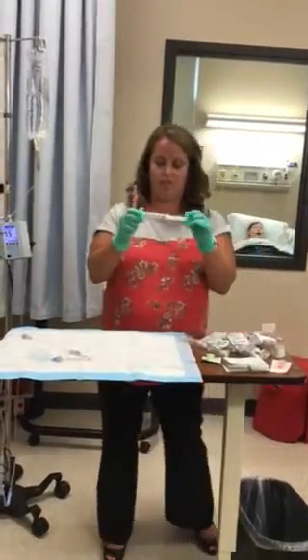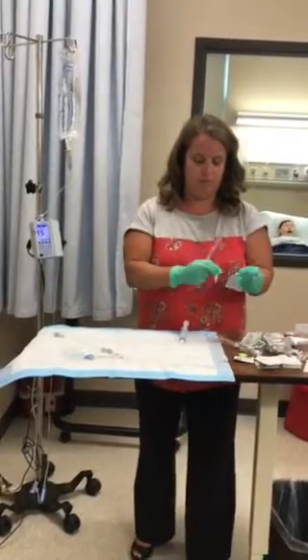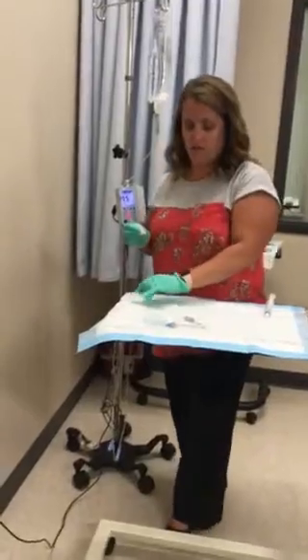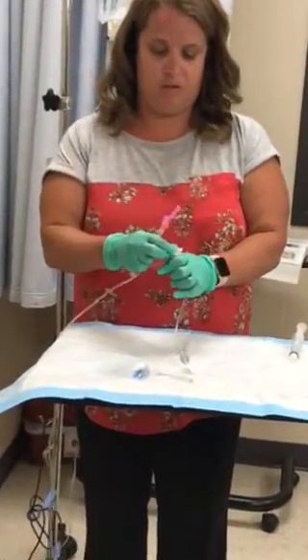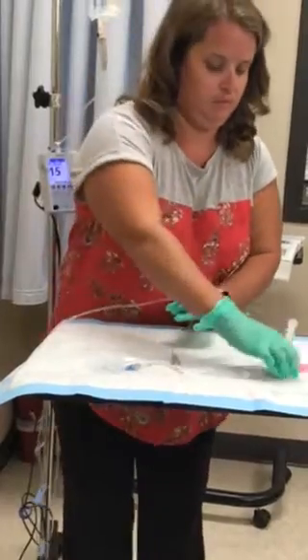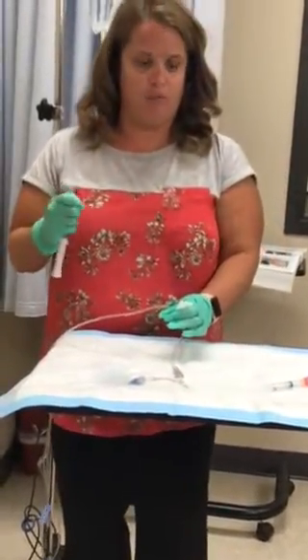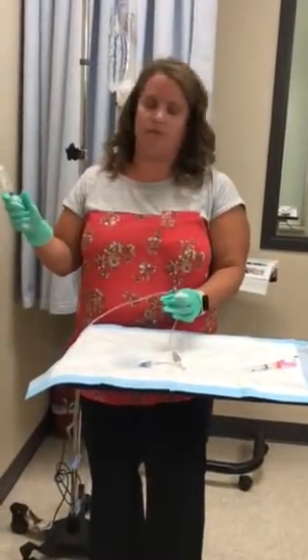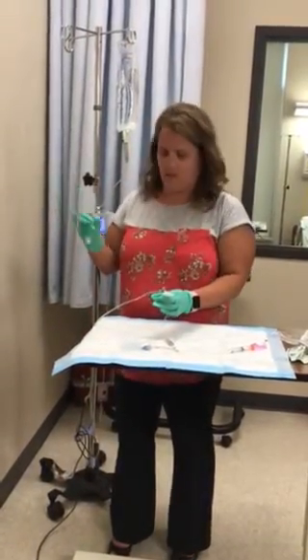I'm going to get a 10 ml syringe flush of saline and some alcohol swabs, and come over here. You want to use the port closest to the patient. You're going to scrub it. Before you give any medicine, you're going to verify the patient's name and date of birth and scan it with the electronic MAR. You're going to discard the air that was in the syringe.